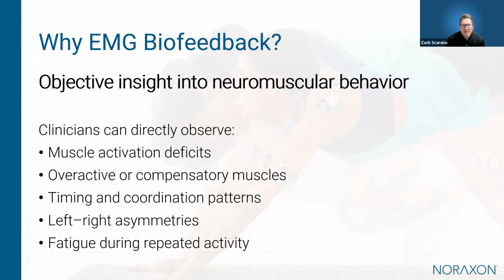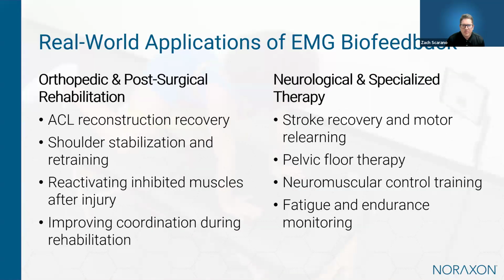So the next question is, where is this actually used in practice? So EMG biofeedback is used across a wide range of clinical scenarios. In orthopedic rehabilitation, it's often used after procedures like ACL reconstruction to help restore the quadriceps activation and overall neuromuscular control. It's also widely used for shoulder retraining, helping patients reduce compensatory activation and restore proper movement patterns.